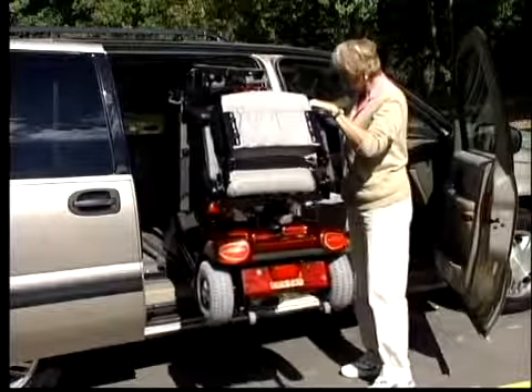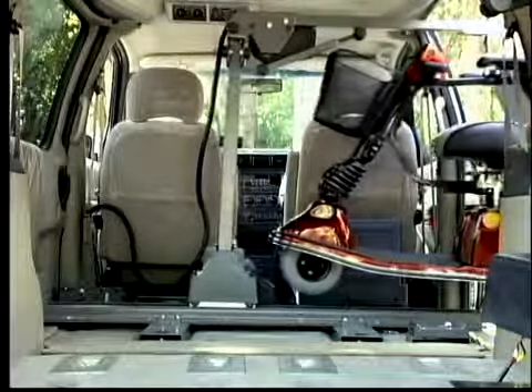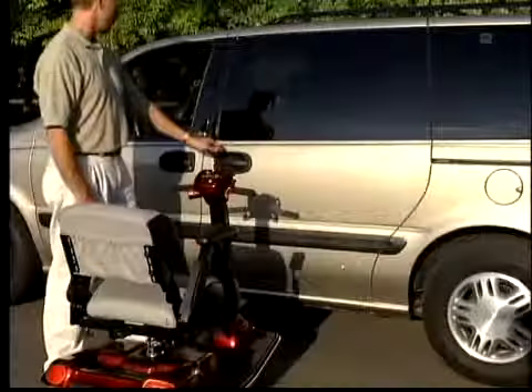Bruno's VSL 900 Scooter Lift 2 raises and stores a fully assembled wheelchair, small power wheelchair, or moderate length scooter through the driver's side or the passenger side sliding door of minivans, mid-sized vans, and full-sized vans.